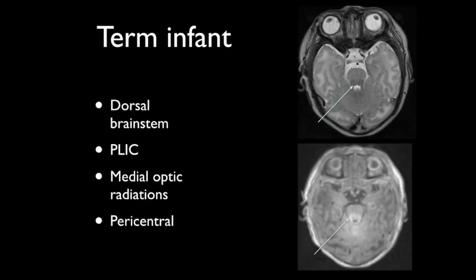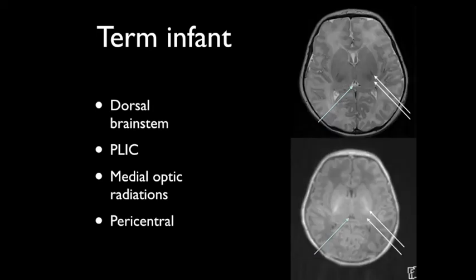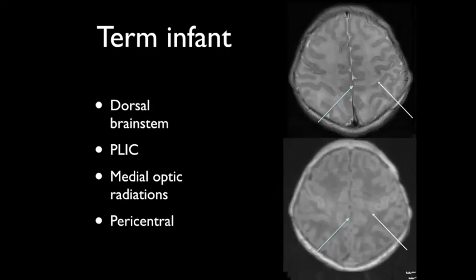To illustrate this, let's look at a term infant here with T2-weighted images on the top and T1-weighted images at the bottom. You can see that the dorsal brainstem indicated by the arrows is myelinated, characterized by T2 hypointensity and T1 hyperintensity. The posterior limb internal capsule is also myelinated, and the ventral lateral thalami are also myelinated. The medial optic radiations are also myelinated, shown by T2 hypointense linear signal. The periorlandic and pericentral areas are myelinated as well. This is a typical appearance in a term neonate.